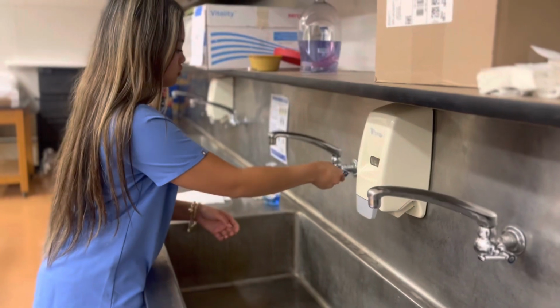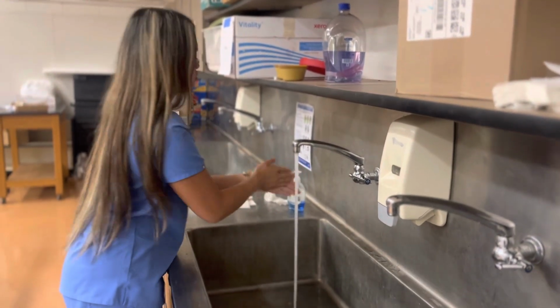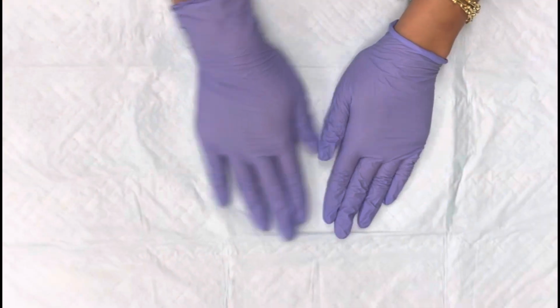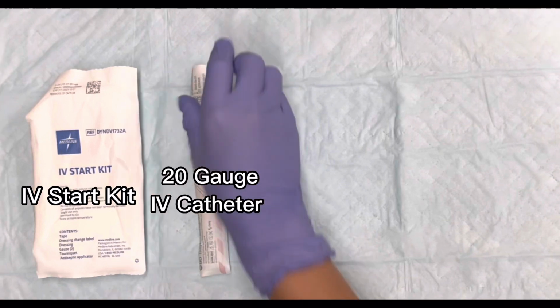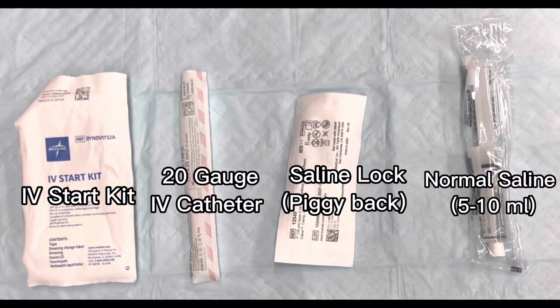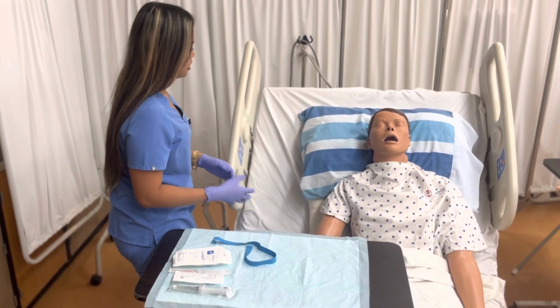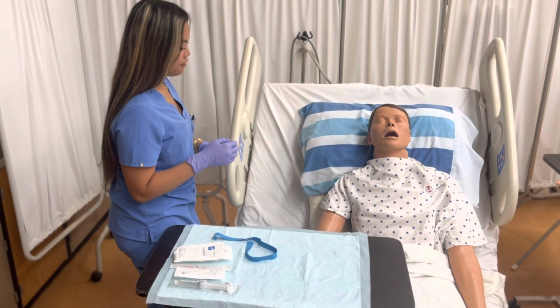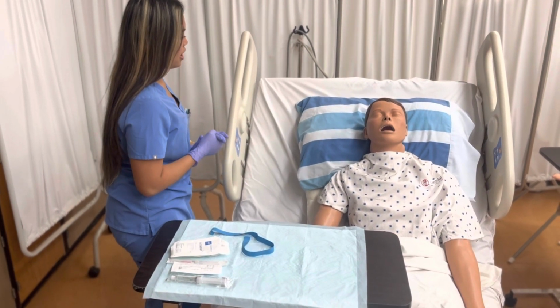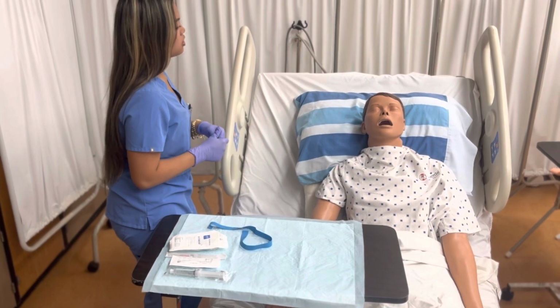Alright. First, perform hand hygiene and apply gloves prior to contact with the patient. Next, gather your supplies and set up materials on the bedside table. Prior to inserting the IV catheter into your patient, make sure to explain to them why they need it. In this case, Robert Smith needs an IV catheter for blood testing and receiving medications.